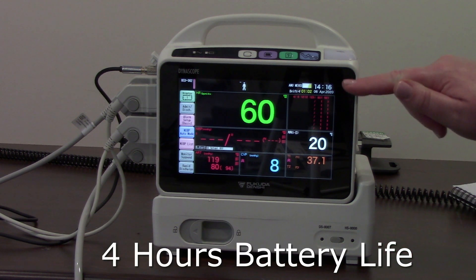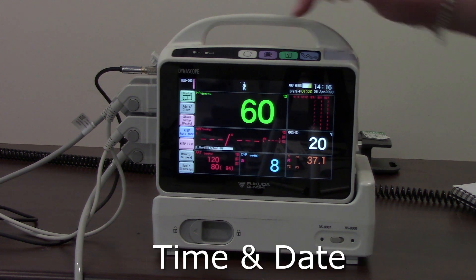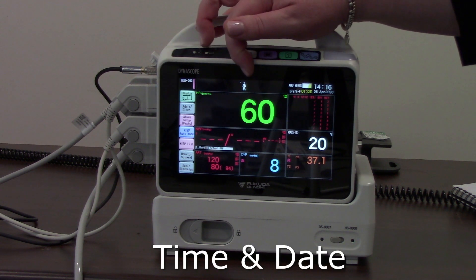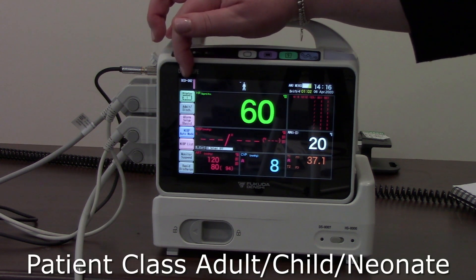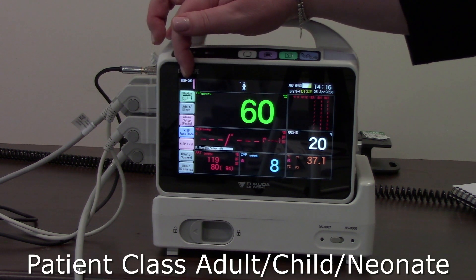You've also got the time and date in this right-hand corner. You have your class of patients — whether it's set to adult, child, or neonate — and then you have your bed number just to the left.